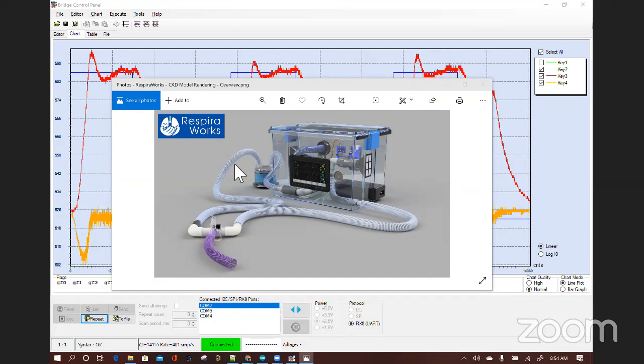And so to pursue that, our goal is to provide two modes of ventilation. In particular, the assist control ventilation, which detects the patient breath, the patient inspiratory effort, and then provides supporting pressure at various degrees of support to change the amount of assist. And then also for patients that are incapable of breathing at all on their own, the pressure-regulated volume-controlled mode of operation, where the automated control of the ventilator controls the entire breathing cycle.